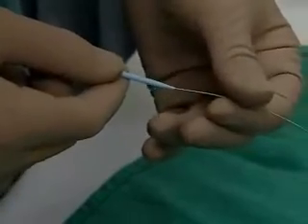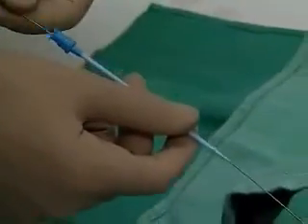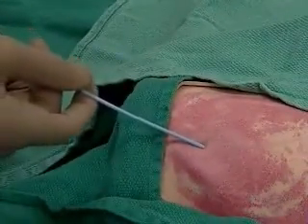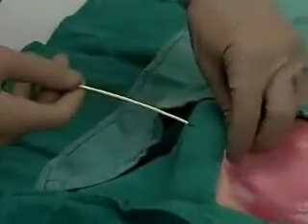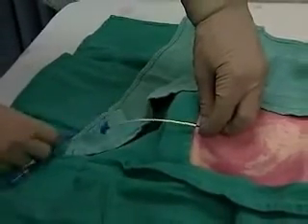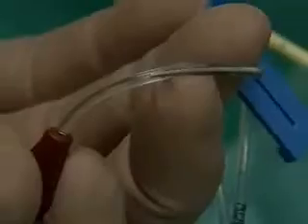We advance the dilator over the wire, advancing carefully to dilate the soft tissue, still holding the end of that wire with one hand. Now we advance the central line catheter over the wire, partly withdrawing the wire if necessary, until the wire is seen at the catheter hub.